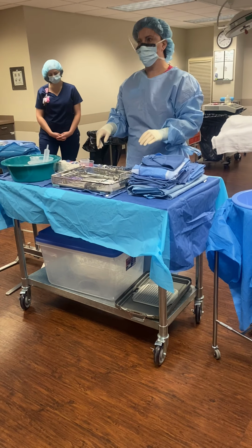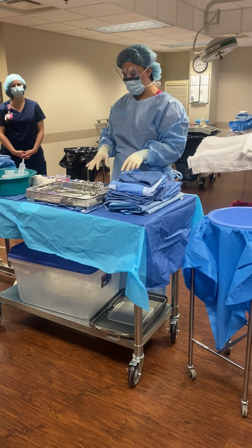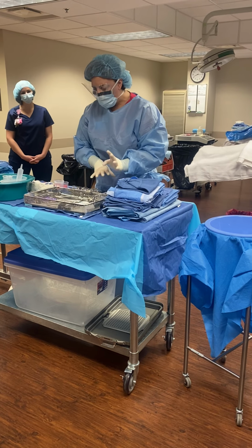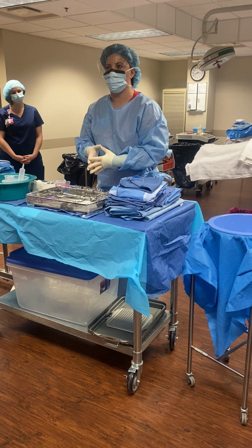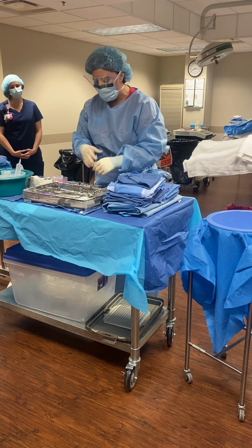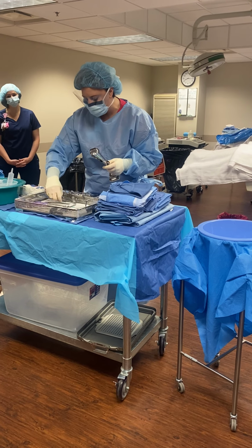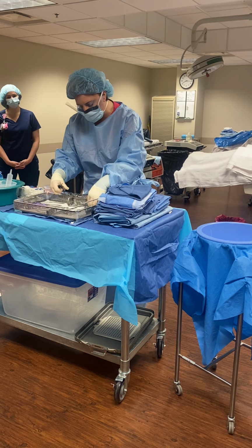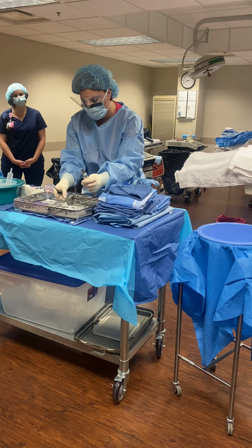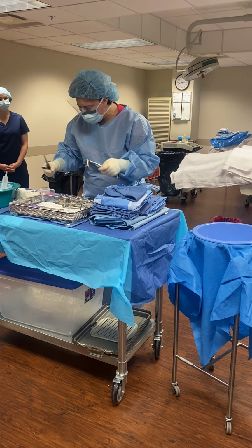So we have a few more instruments now. I didn't forget that you guys were there. So when you bring your instruments to your field, just organize your tray. Just organize it a bit. This will be a good habit for when we get ready to start counting instruments, right? So we'll just tidy this up a little smidge. I'm going to need those, so I'll take those out.